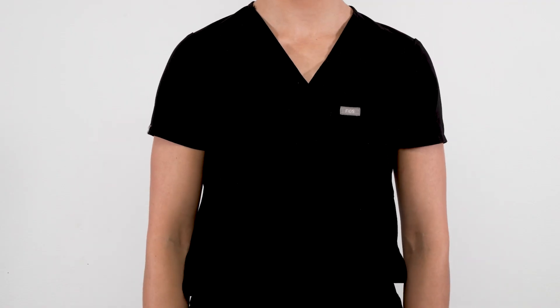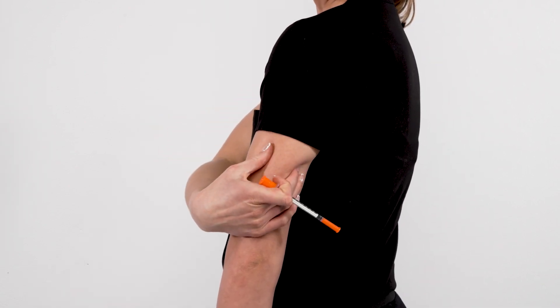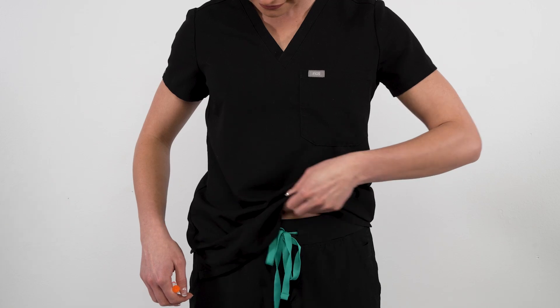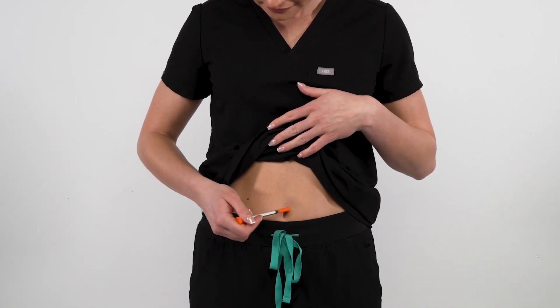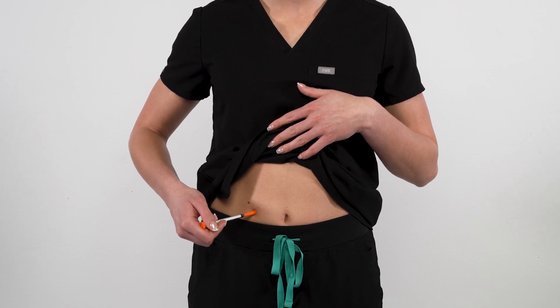When you're administering a shot subcutaneously, there are three different areas you can choose to do so. One, the upper arm. When administering a shot in the upper arm, you will want to inject the backside of the arm, halfway between the elbow and the shoulder. Two, the belly. When administering a shot in the belly, inject below the ribs and above the hip bones, at least two inches away from the belly button.